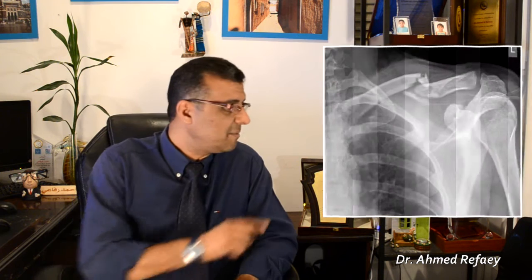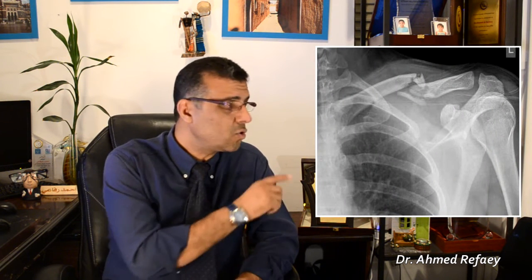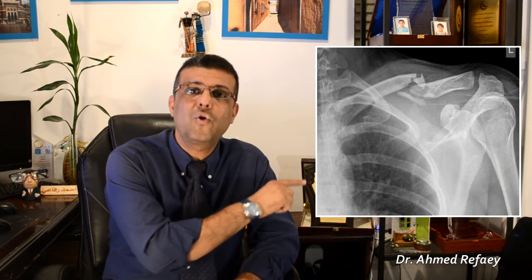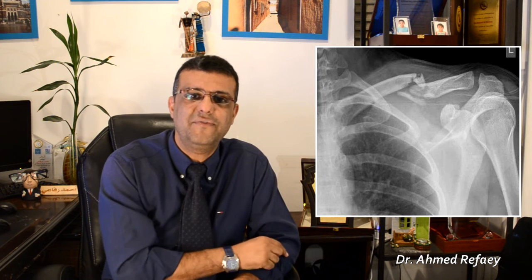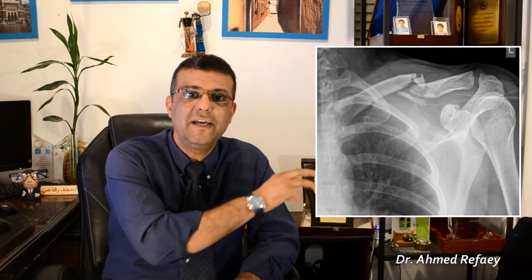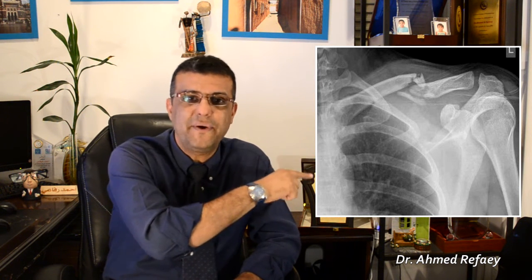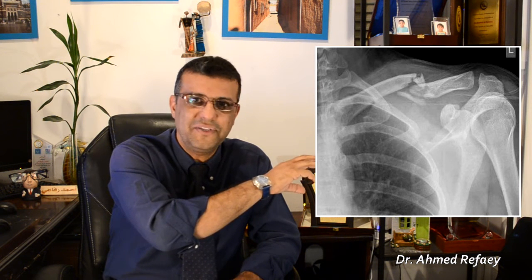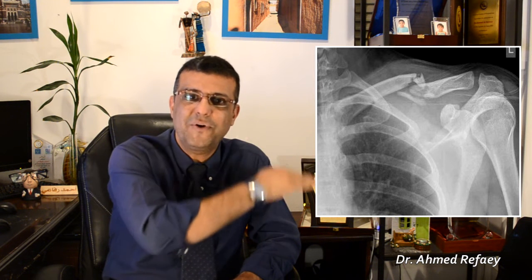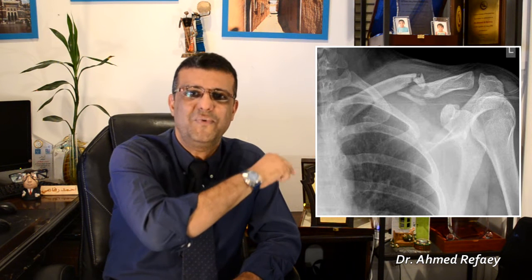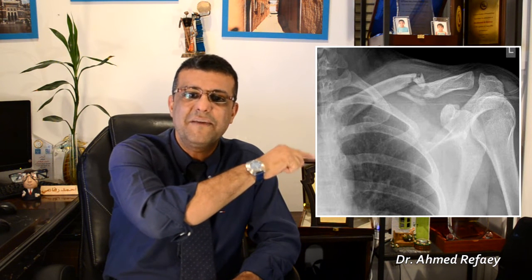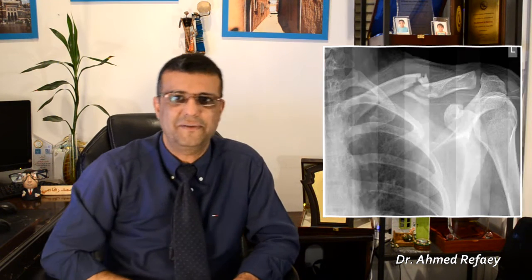Case number four. This is a complete, comminuted fracture of the mid-shaft of the left clavicle, associated with some shortening as there is overlap of the fractured ends. There is also downward displacement, because we describe the displacement of the distal bone fragment — and here the distal bone fragment is displaced downward.